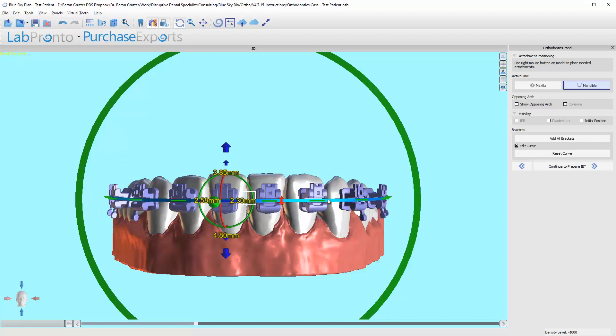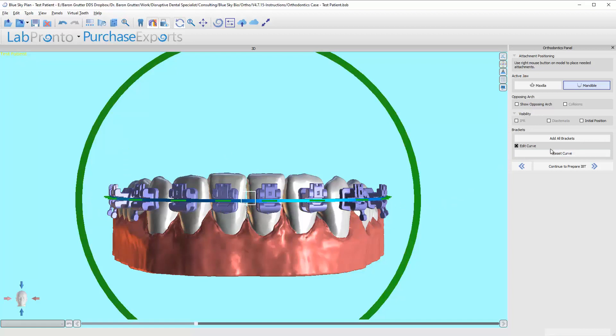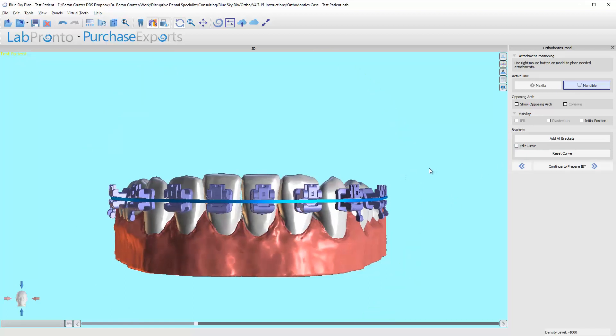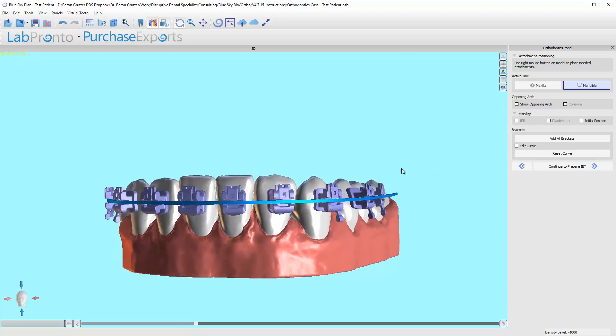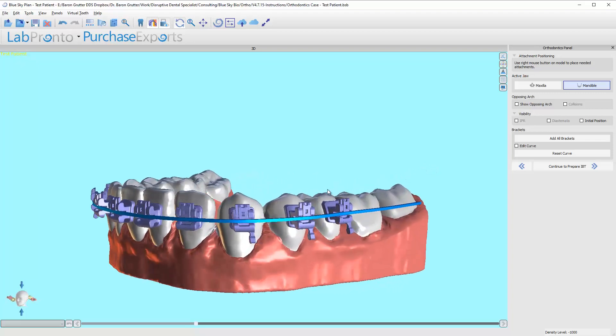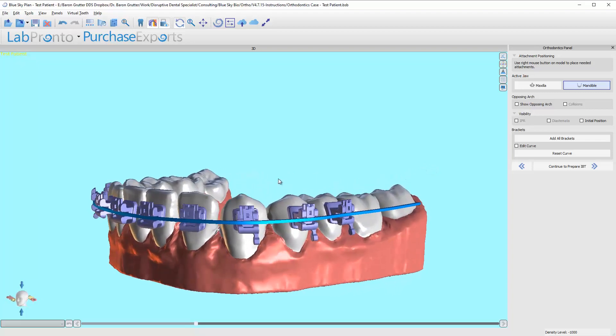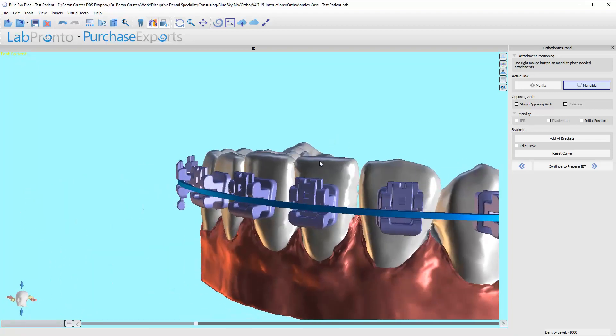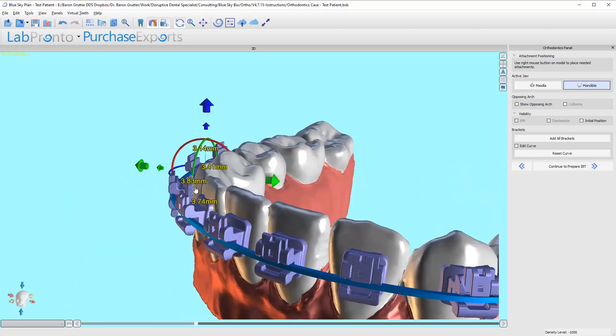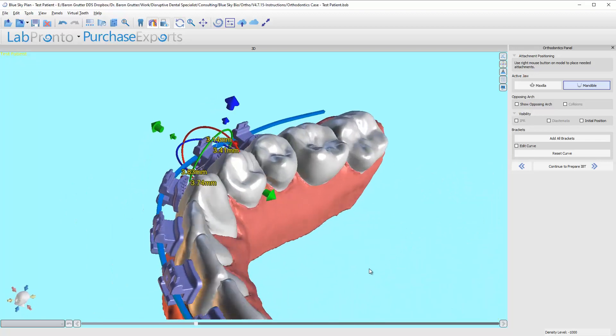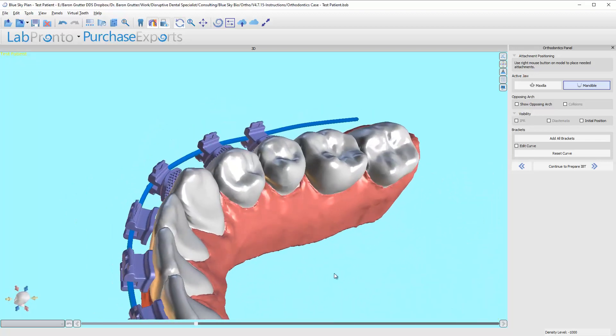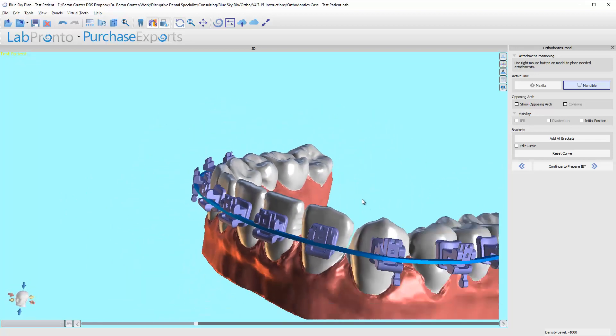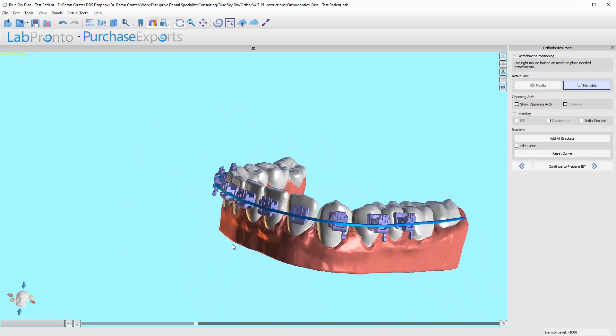This might look weird to you. I'm going to turn off the curve right here, I'm going to hide it so I can see something a little better. If you swing around, you'll notice that there's actually space between the bracket and the tooth. That is there intentionally.